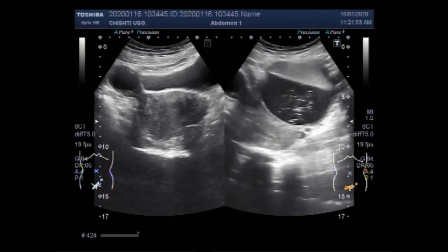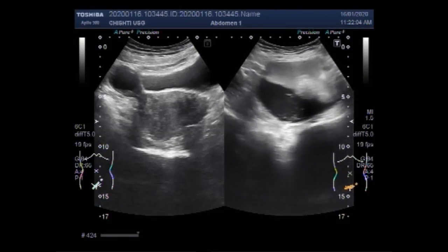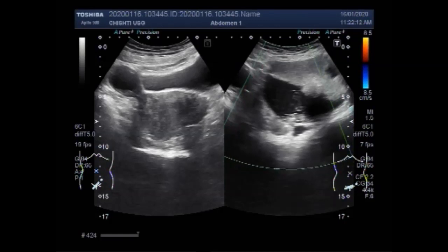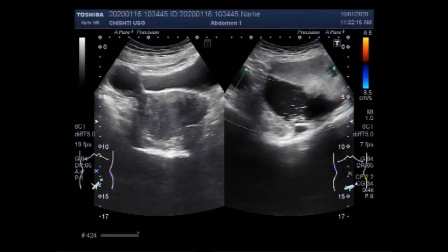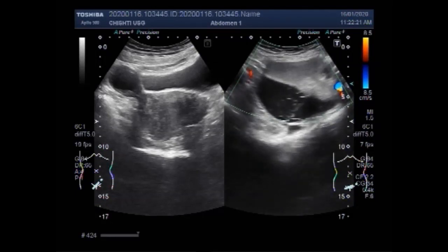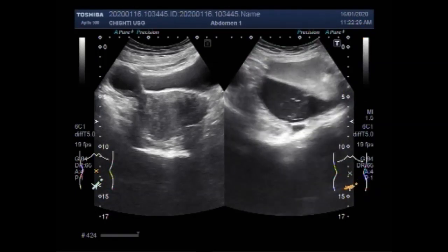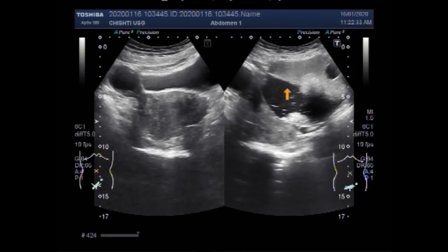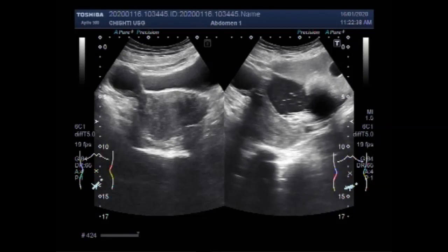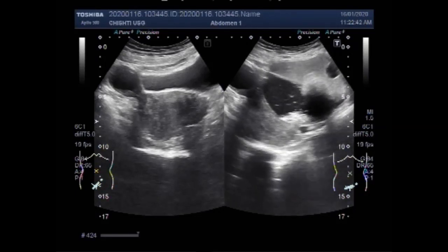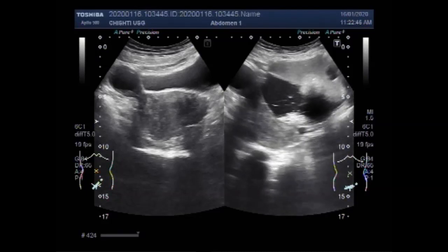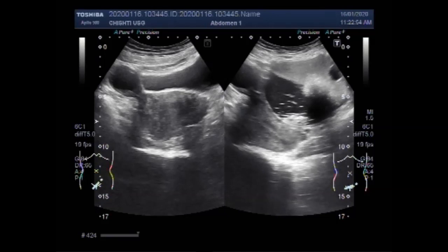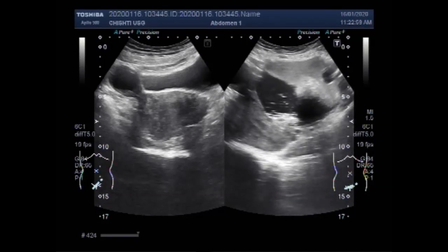The fluid is thick and turbid, having multiple internal echoes — this is the large hemorrhagic ovarian cyst. You can see the blood flow: no significant blood flow is seen. Internal bleeding or hemorrhage has taken place in the cyst.